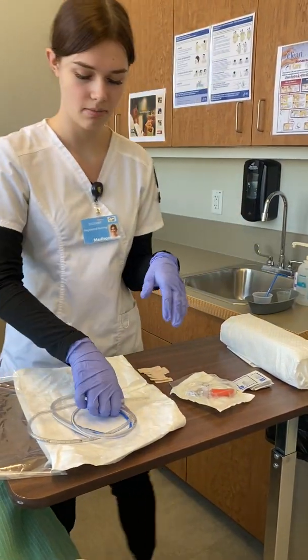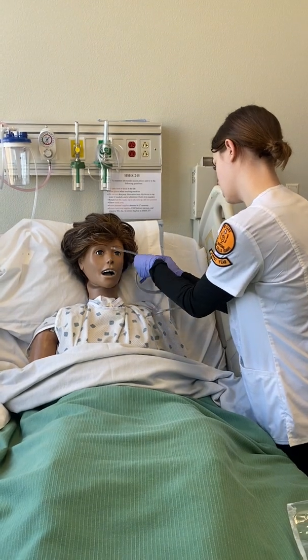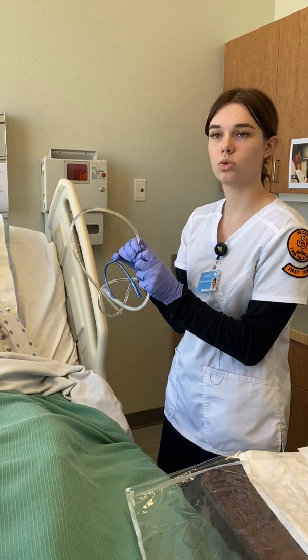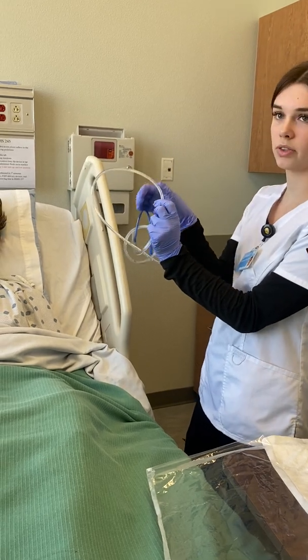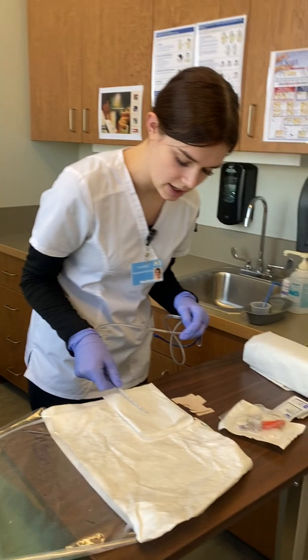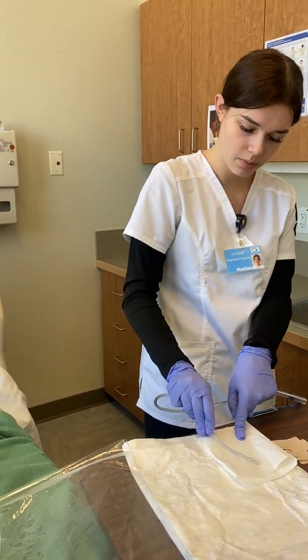All right, we're gonna go ahead and measure. So I am just measuring from your nose to your ear, and then we're gonna measure from your ear to your xiphoid process, and then we're going to add about 15.2 centimeters, and then I'm at 45 right now, and we would just go ahead and mark this with a water-soluble marker. Right. Just going to go ahead and dip this in the lube. Get all lubed up.